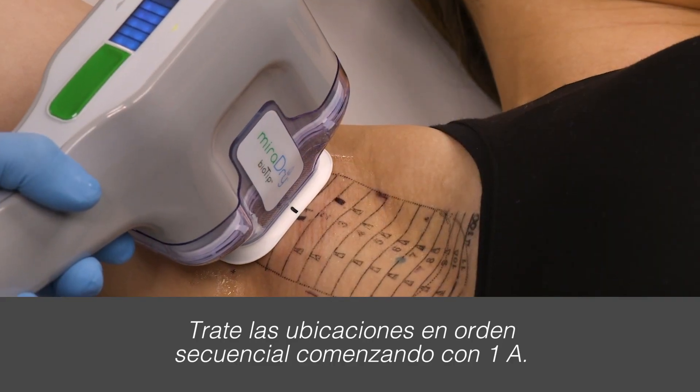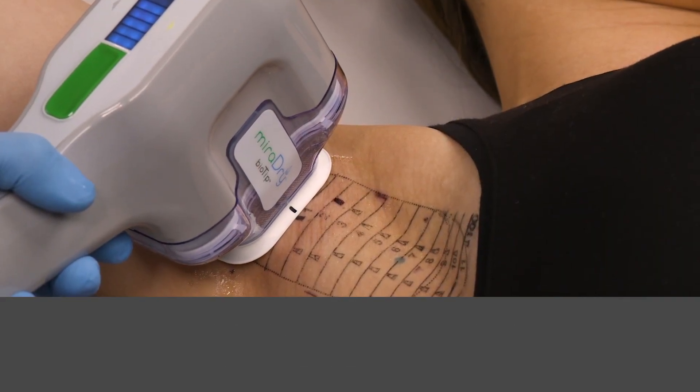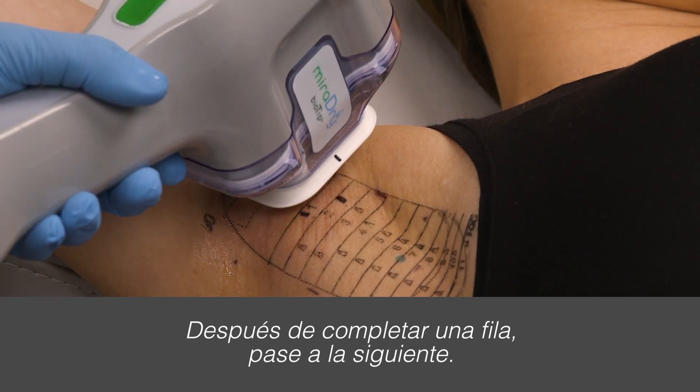Treat placements in sequential order starting with 1A. After completing a row, move to the next.